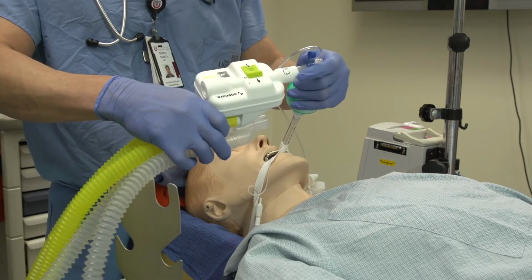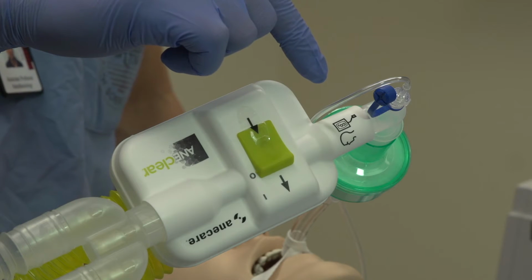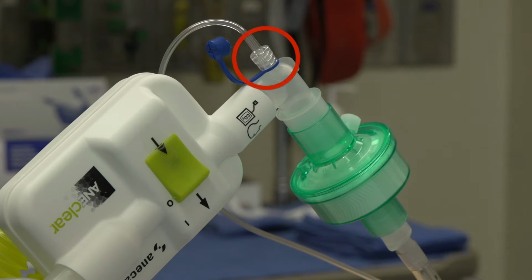Place ANEclear between the patient and the anesthesia breathing circuit, noting the visual image prompts on the device for correct placement. ANEclear can be used with either a dual limb parallel Y or coaxial tubing anesthesia circuit placed behind the device. The gas sampling port needs to be placed between the patient and ANEclear to ensure that the displayed gas readings represent the actual inhaled and exhaled gas concentrations of your patient.